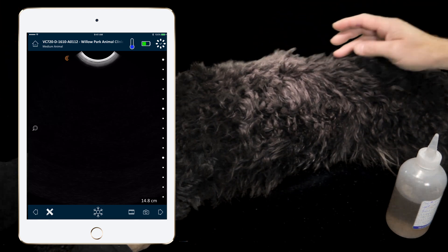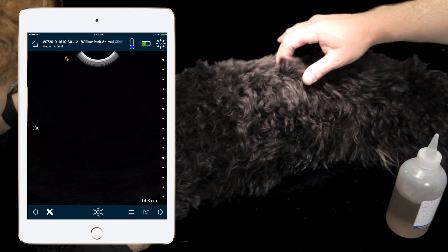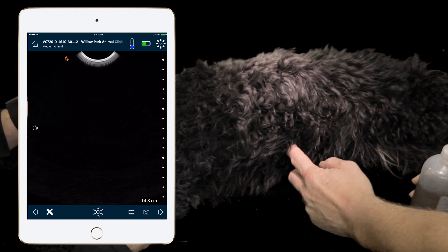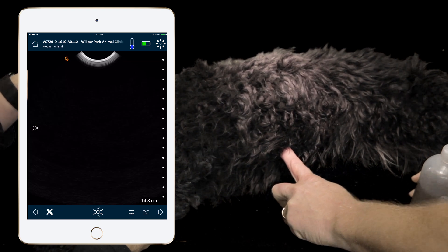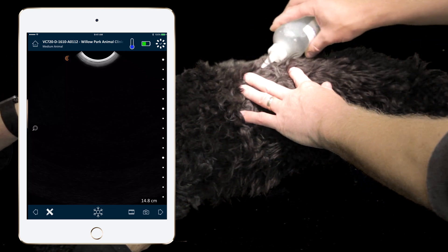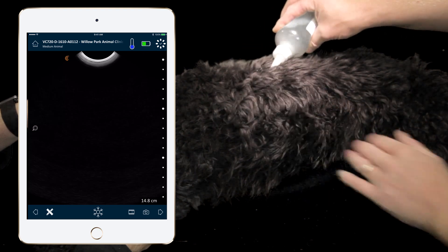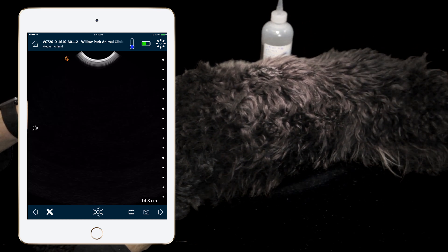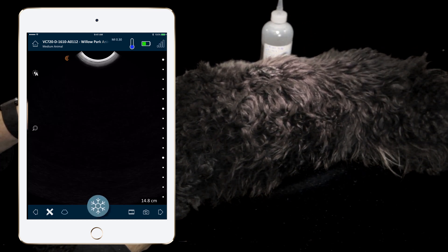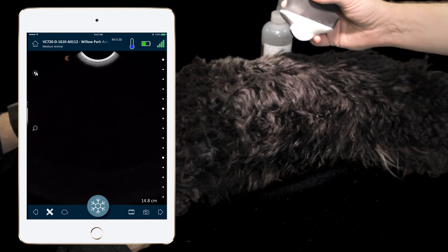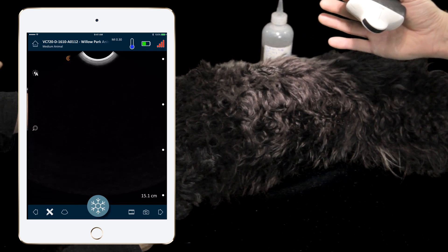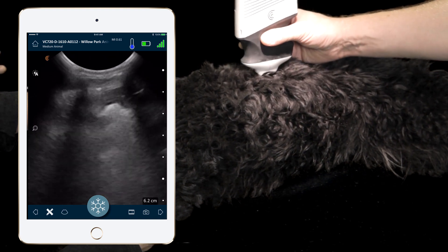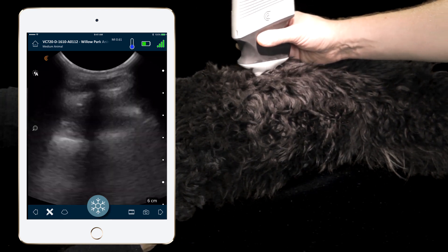To find the chest tube site, you can count externally from the last rib forward to the 9th, 8th, or 7th intercostal space. A shortcut is to trace your finger cranially from the sub-xiphoid then move it dorsally to reach that same spot. We apply alcohol, separate the fur, and because we're looking at the pleural interface — between the lung and the inner thoracic wall lining — we decrease the depth setting to about six centimeters, depending on patient size.